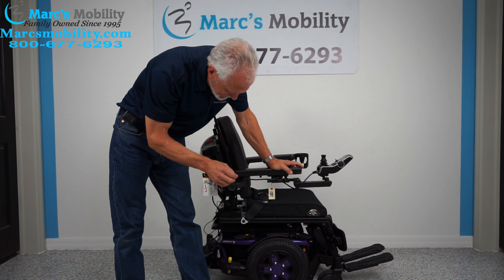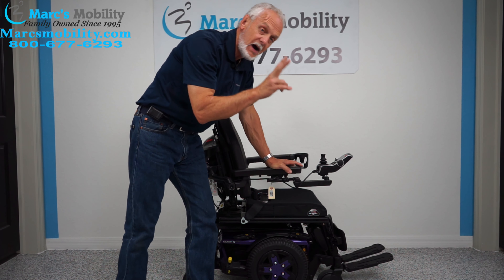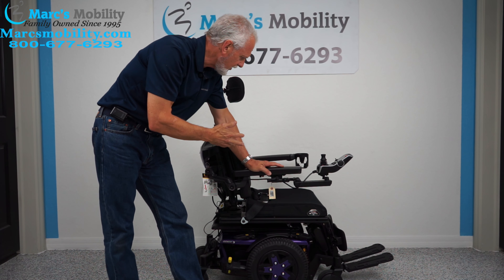We have here a Quantum Edge 3 power chair, purple in color. This chair has two miles on it, so it's practically brand new.